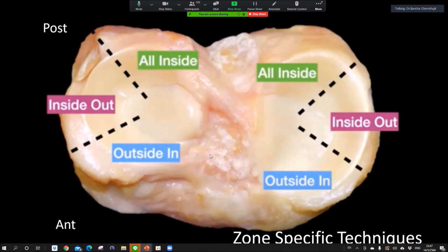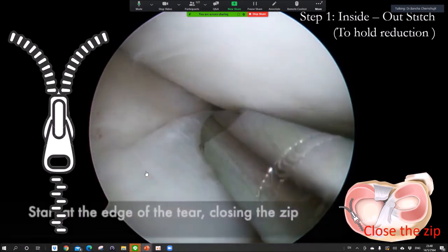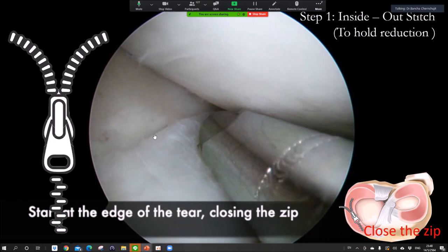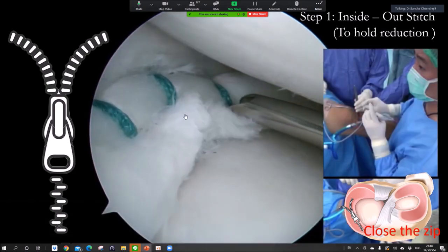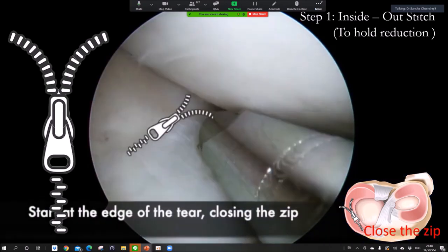To summarize the technique: use outside-in for the anterior part, inside-out for the body, and all-inside for the posterior part of the meniscus. My trick is the 'zip technique': after you locate the meniscus, always start reduction from the anterior part, because from there you can reduce the meniscus perfectly — like closing a zip. If you repair the middle first, sometimes you don't get an anatomic reduction. Use this technique to reduce the meniscus properly.